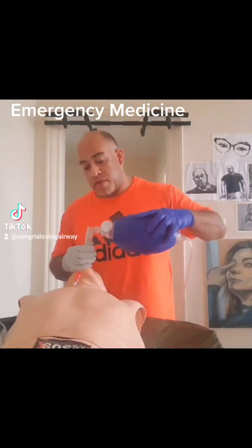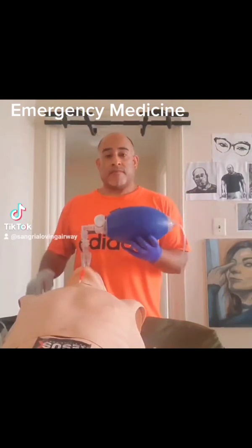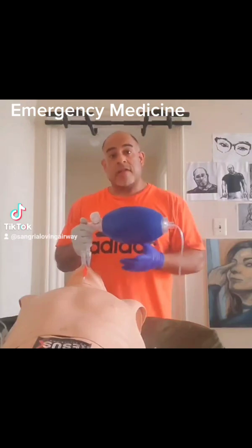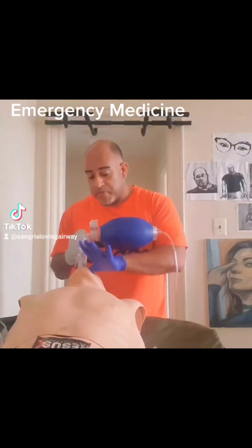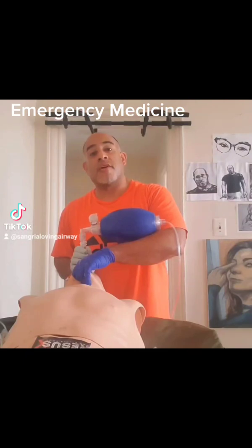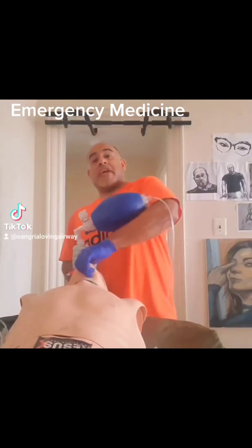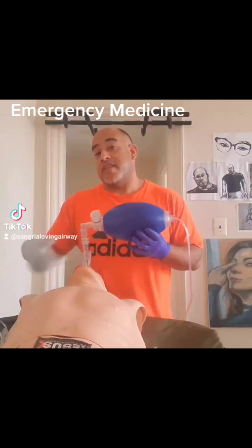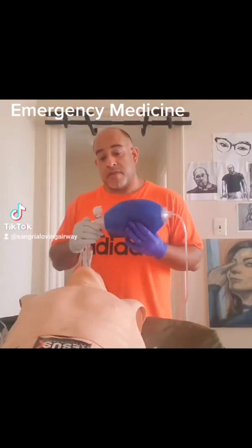Put it in, and make sure you have end tidal to prove to everyone in there that this is working, right? I put a ring on it. That was the technique I just quickly did. Distract the jaw by grabbing the tip of the tongue, right? Grab the angle of the jaw along with the tip of the tongue. Distract anteriorly and push down, and that quickly places the supraglottic airway. Put end tidal on to confirm that you're truly ventilating with supplemental oxygen, right?